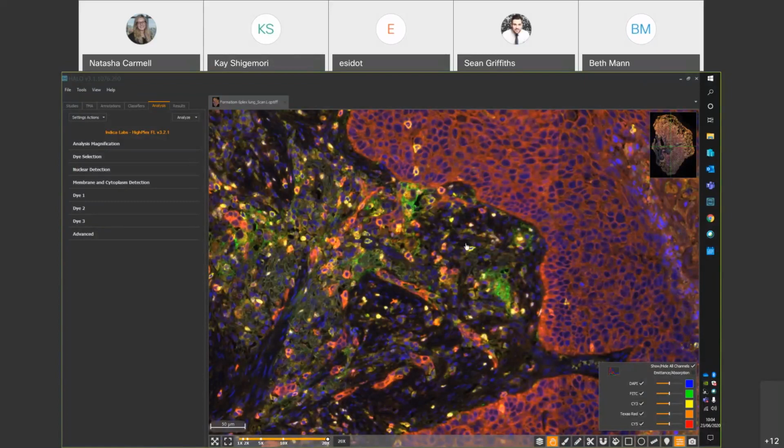We're taking a look at a fluorescent image with 5 different stains down here, or dyes should I say, and with any fluorescent image in Halo, you can toggle all of these off and on using the tick here, and you can actually collapse this channel box as well.